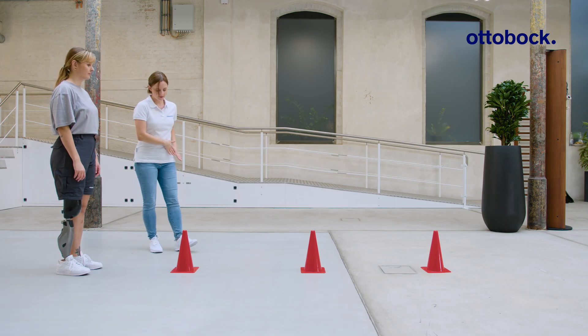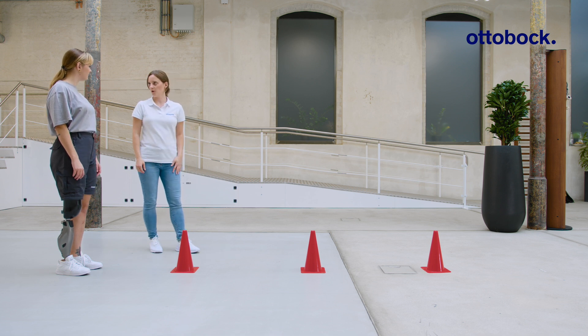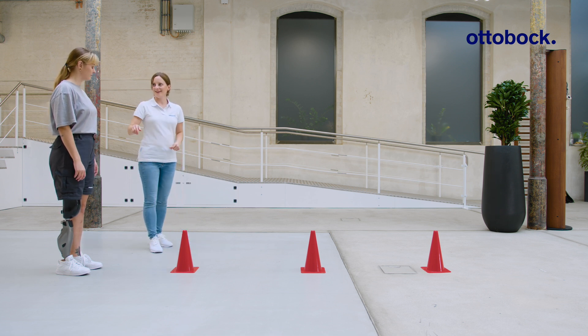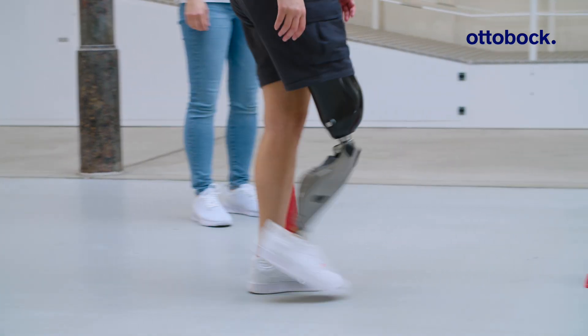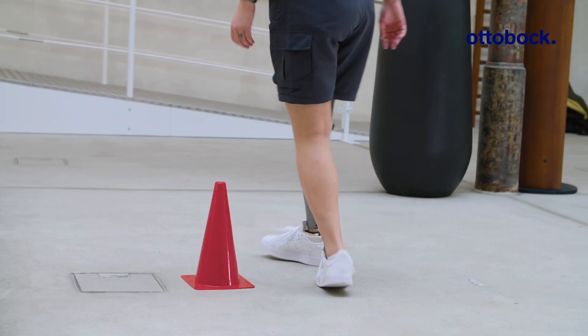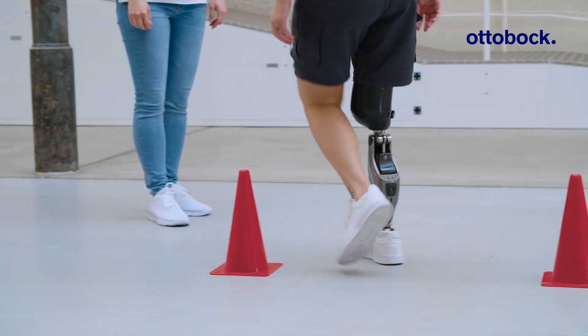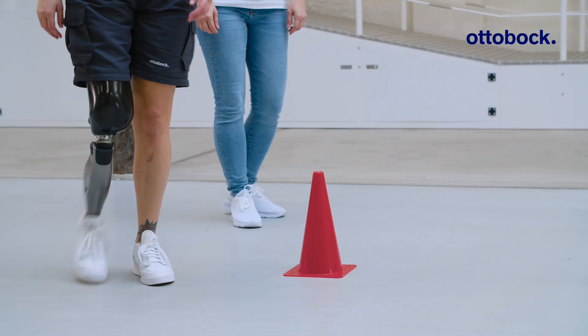The following exercise helps to further improve the walking technique. In everyday life, there are many situations in which walking with small steps is required. This is often difficult for beginners as it requires good balance and confidence. The quality of movement and coordination is more important than the strength exerted.